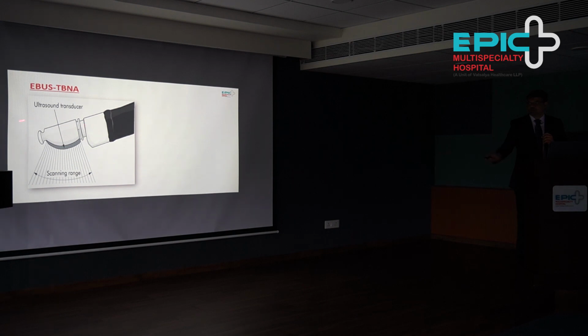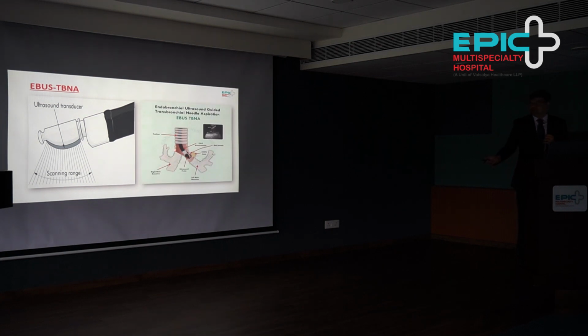This is the ultrasound transducer, and here there is a camera which can give us the endoscopic image. And this is how it works: once we pass through the trachea, we have the endobronchial ultrasound image, we can visualize the lymph node, and in real time, we can get the sampling.